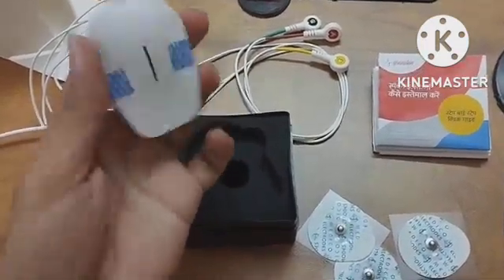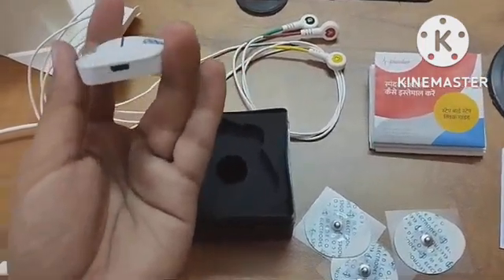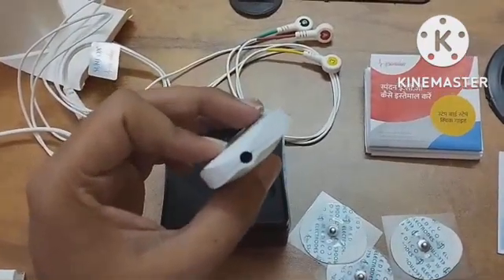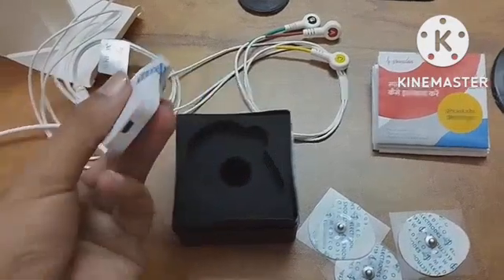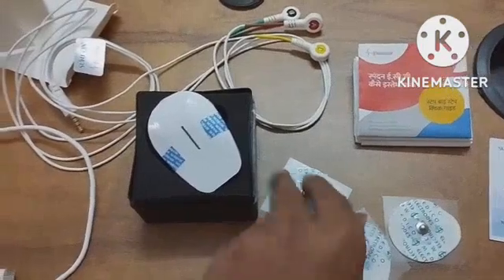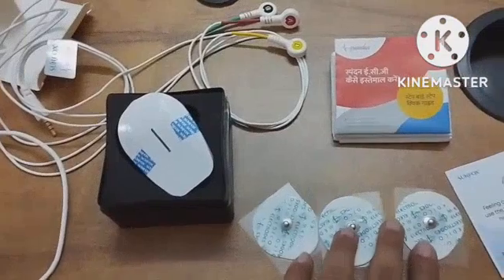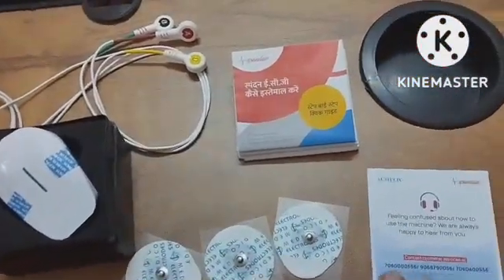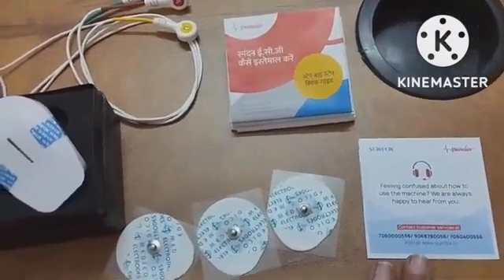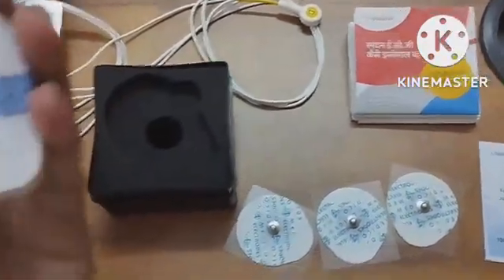Here they have provided two sockets — one for attaching to the mobile and one to the device. They have also provided disposable electrodes, 12 in total, and one warranty card with a helpline number. This device comes with two years of warranty.